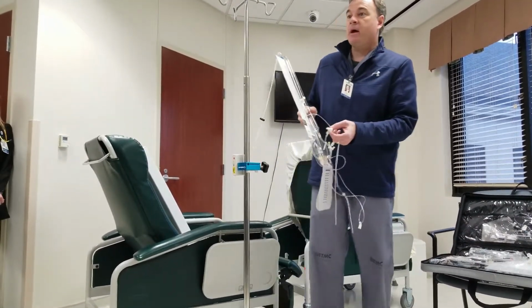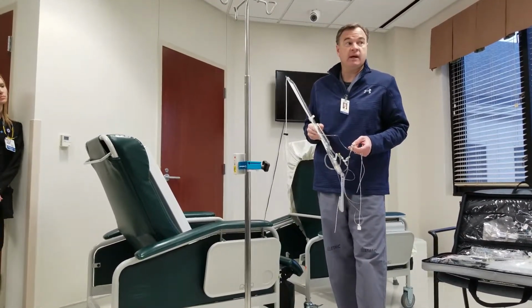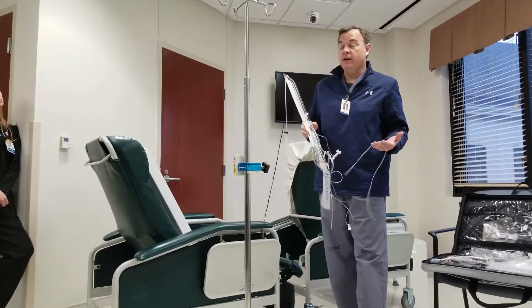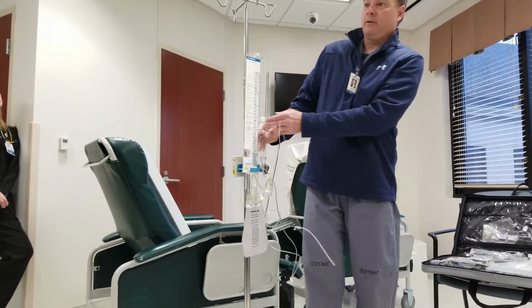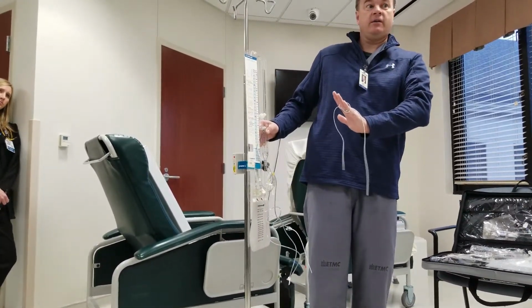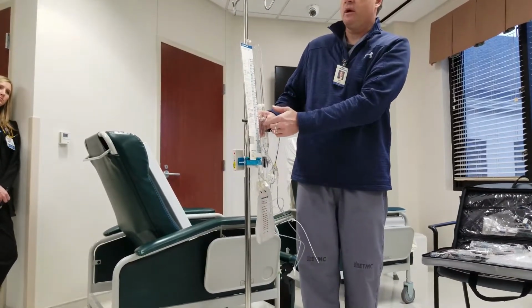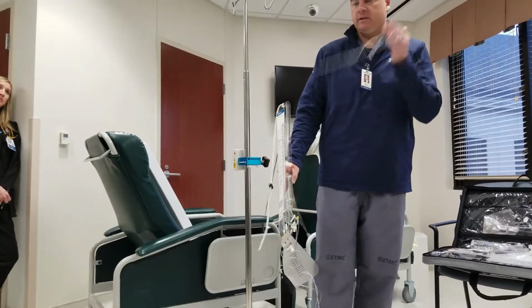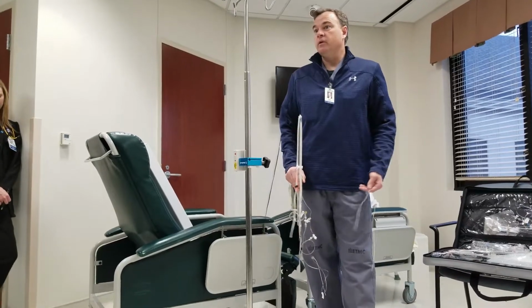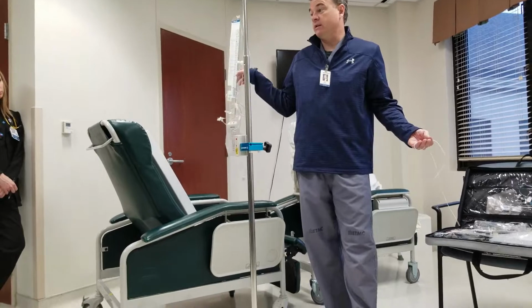So all of the stopcocks in that scenario would be open, right? I know there was a question earlier with the patient we just had about whether to keep it open or not. The safety valve, in essence, is the setting that it's up higher, right? So gravity is actually your friend, causing a resistance, and that's why you see a drip. Now, if this were to hit the floor, obviously it's a free-flowing drain, and that's a problem. But everything stays open in the pressure setting scenario.